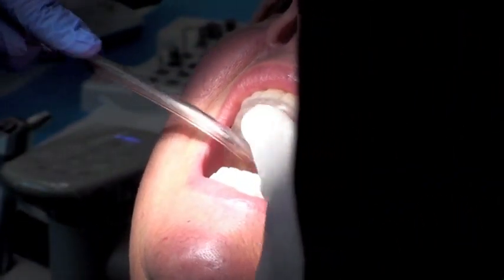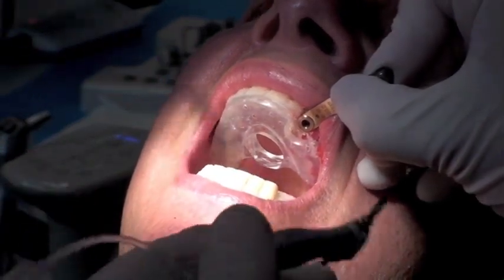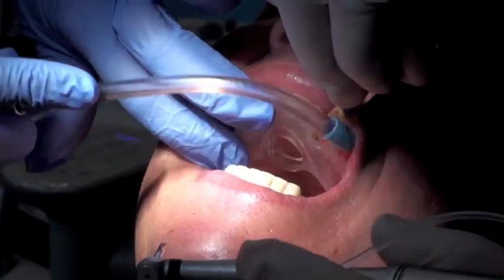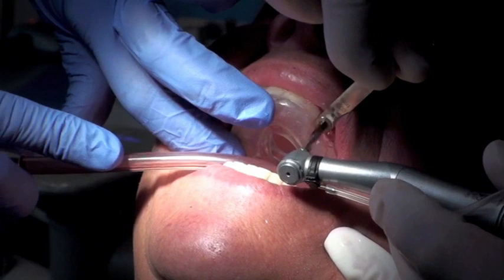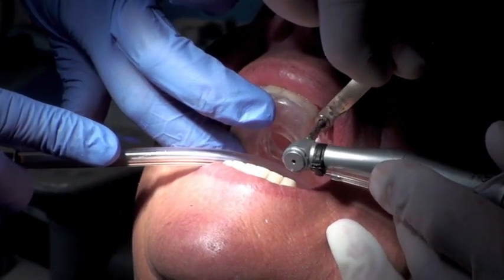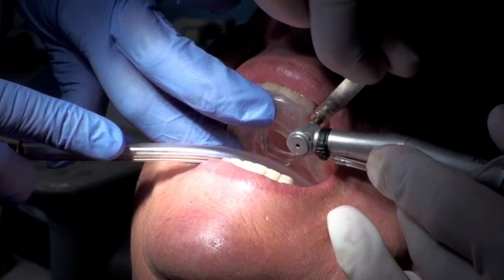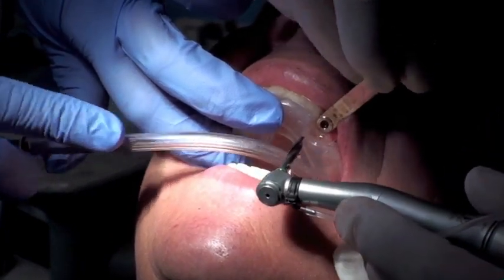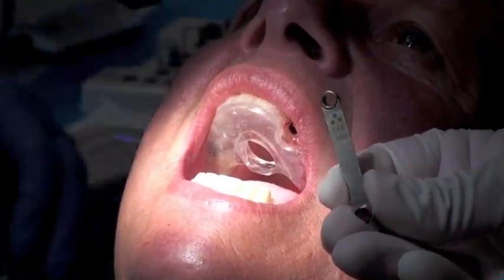If you observe very carefully, you can see how accurate this drill is actually being sequenced. There's no waver in angulation, and the key allows me to go to full depth. So there's a stopper that's built into the osteotomy drill. From the 3.2 we go straight to the 4.5 conical.